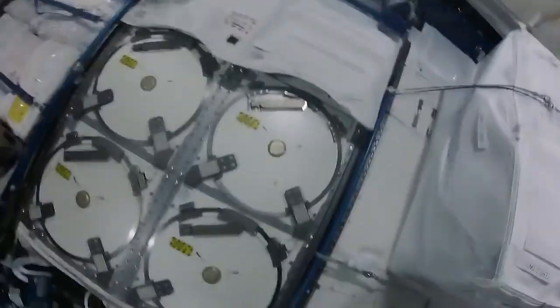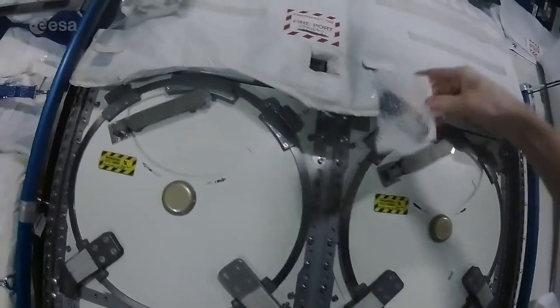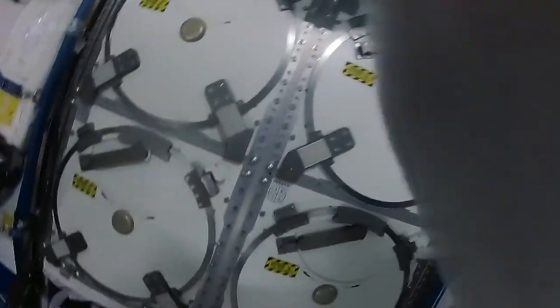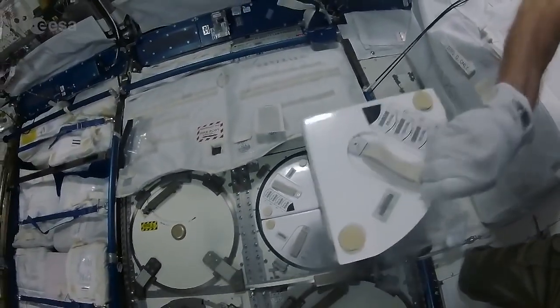Here we are in the Japanese module, the JPM, and these two blood tubes are going into the MELFI down here. I've written on my hand the location so I don't forget — two delta drawers three and four. I've put the two blood tubes into a small mesh bag. Number two delta is in here. Before I do that, I'll just put on some gloves because this thing is cold and if you touch the metal it'll give you an ice burn. Open the door — two delta, three and four will be in here.